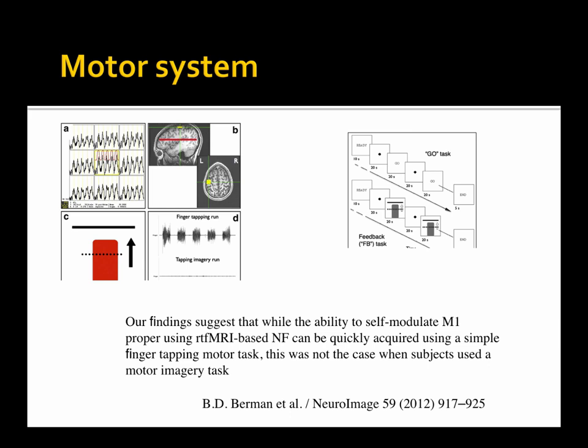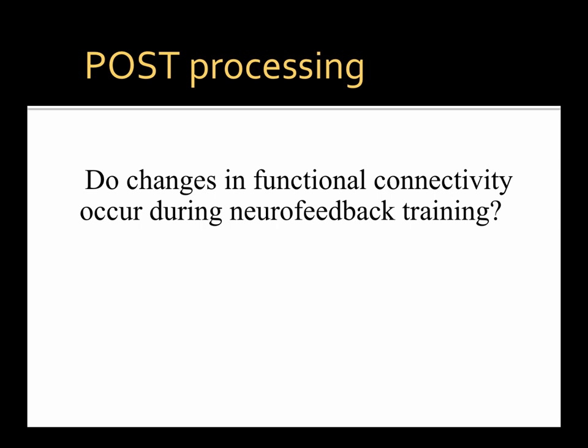And these things could have relevance in trying to work with people that need to go through rehabilitation, for example, because in those cases, you can't tell them to imagine moving while they're trying to move, and then you can see whether the motor cortex starts having some activation. But the question that we had was whether the areas decrease during the feedback. The motor cortex per se did not change during the imagining, but what happened with the connectivity?